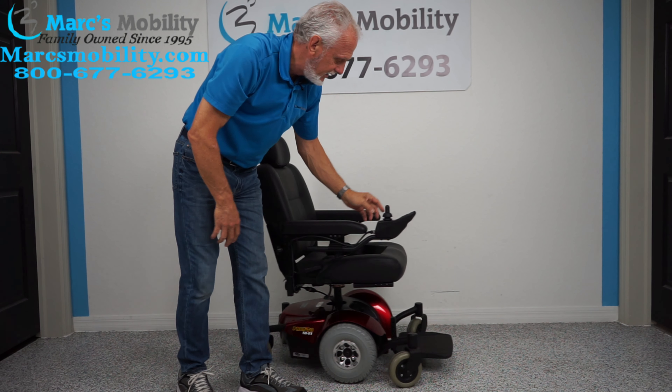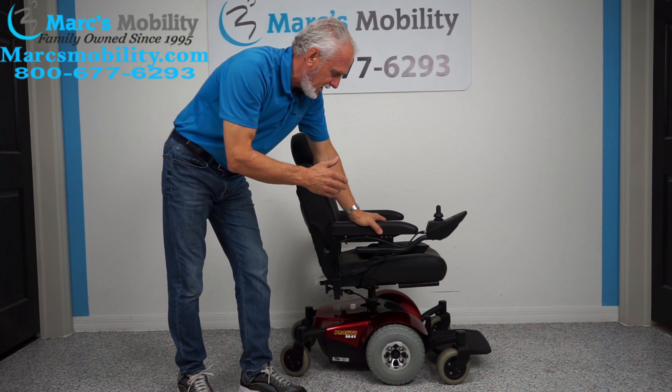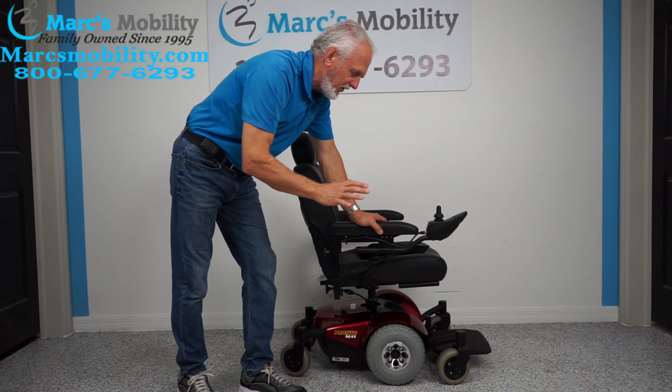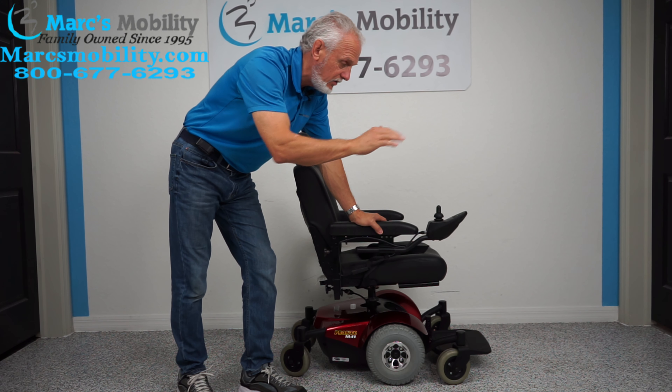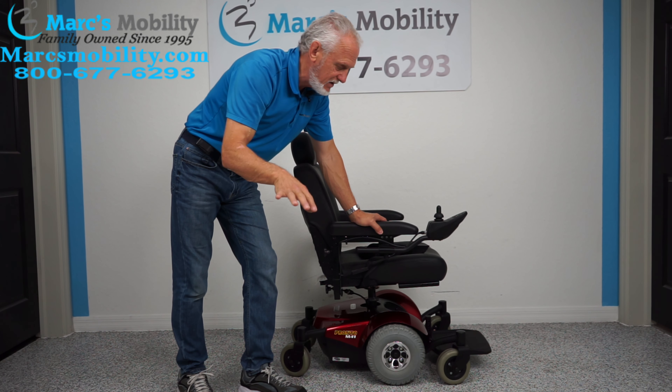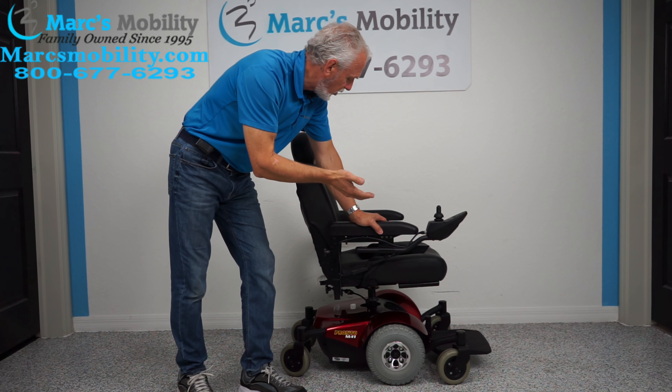With two batteries, this chair will give you up to about 15 miles on a battery charge. Everybody gets a different range — if you're going uphill, in the grass, going fast, or depending on your weight, you're not going to get 15 miles, but they do go a long, long ways.